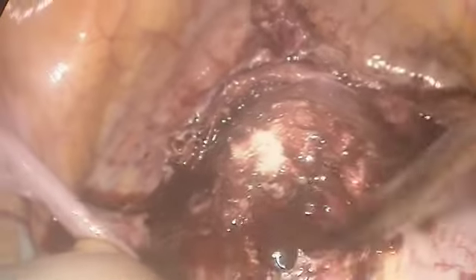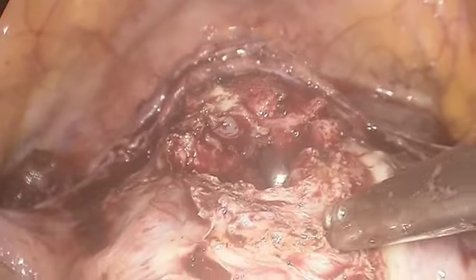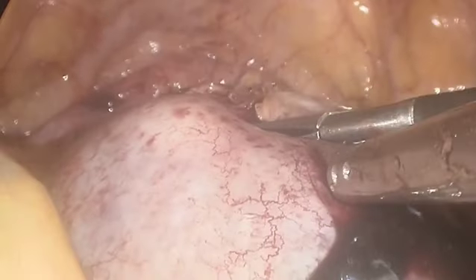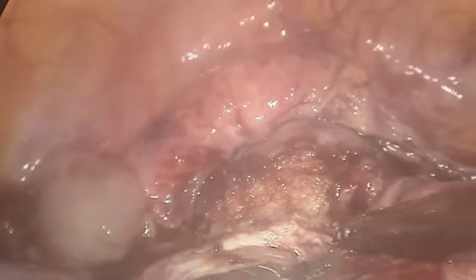Step 6. To ensure proper orientation of the cavity, a cervical dilator is passed from the cervix into the uterine cavity through the scar tract. This helps in two ways. It confirms continuity with the cavity, and it prevents accidental narrowing while suturing. This is a useful tip to keep in mind for future cases.